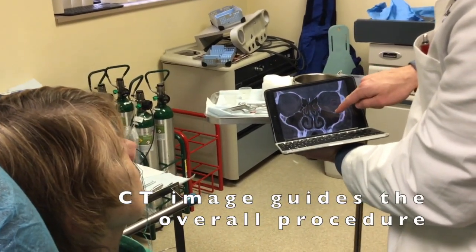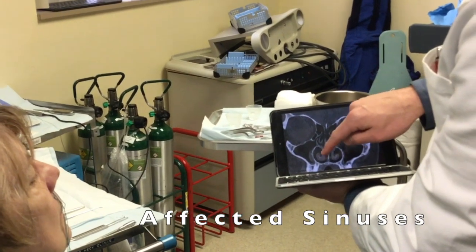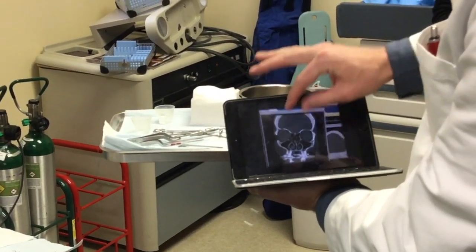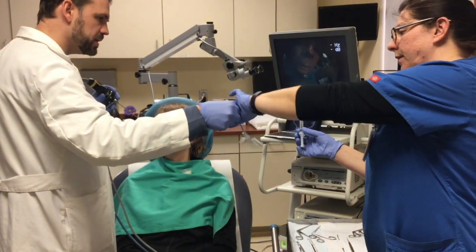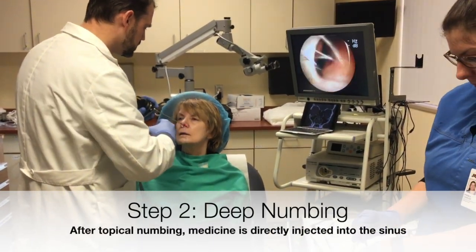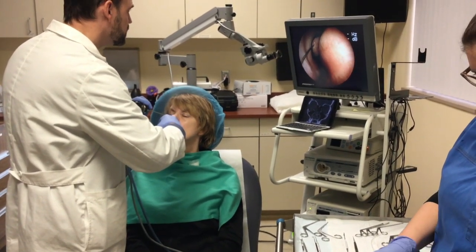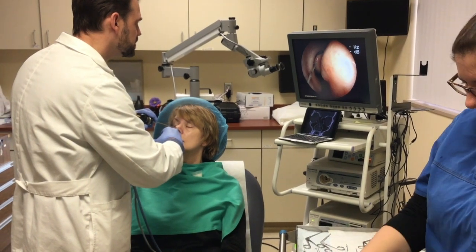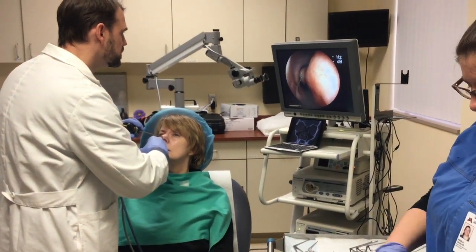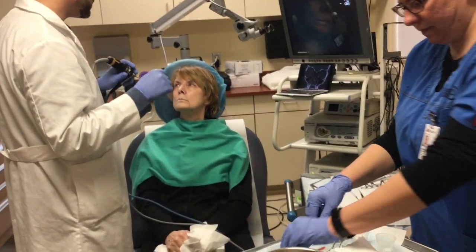We think one of the main sinuses we're dealing with are the maxillary sinuses. These are the sinuses behind your cheekbone, and you can see there's evidence of chronic inflammation or a swelling of the tissue in the maxillary sinuses. We're going to go in there and do the balloon procedure to enlarge that opening. We'll switch once I go back to this side. We'll switch to the longer one. Hopefully, that's the most that you'll feel. Sorry, guys, I'm just injecting the middle turbinate there. After I do this last injection, we'll get you comfortable.